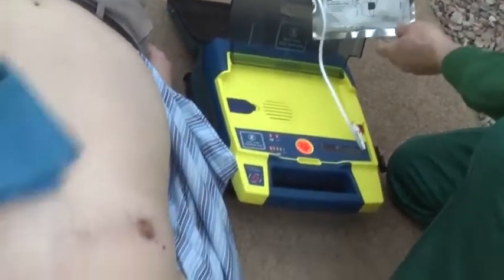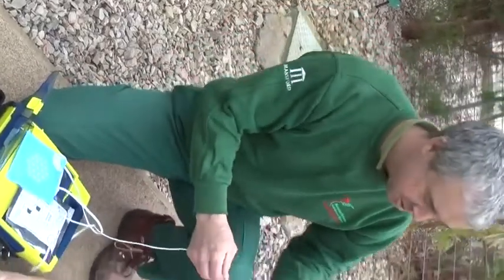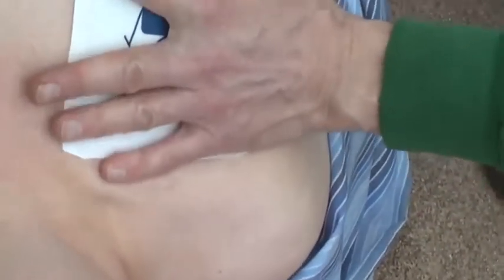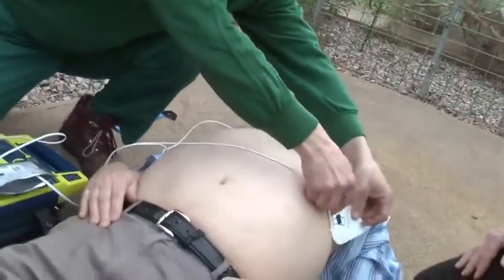Tear open package and remove pads. Peel one pad from plastic liner. Place one pad on bare upper chest. Peel second pad and place on bare lower chest as shown.